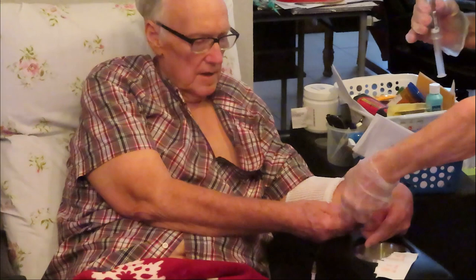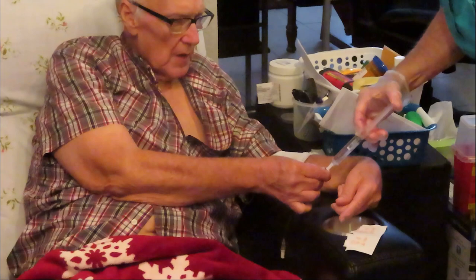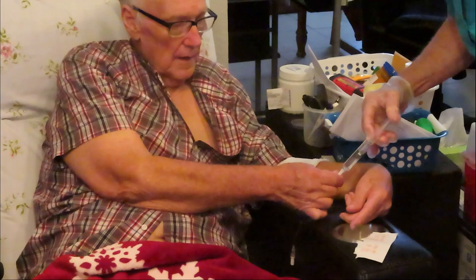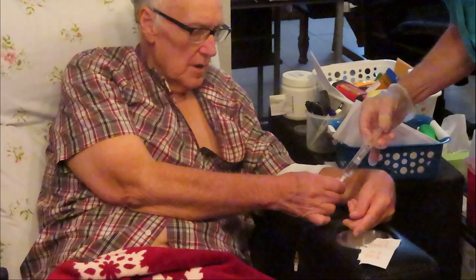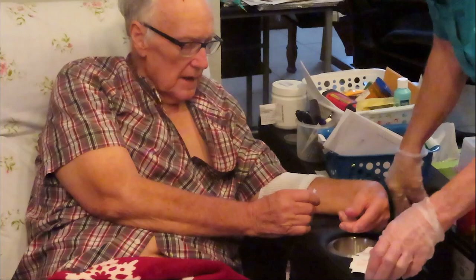And now I just make sure she doesn't take any of my tube. And she pushes it in. Now some go slowly and some push it in, which every time they do that, it makes my thing bleed. So I just recommend pushing a little, stop, pushing a little, stop, pushing a little, stop, pushing a little, stop, and here. She did, okay. She made sure that the air was out of that syringe before she started.